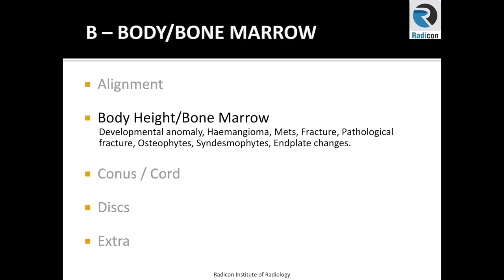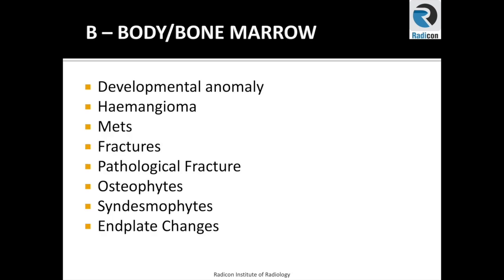Next is body height. In B for body height, we will have a quick look at developmental anomalies, hemangiomas, mets, fractures, pathological fractures, osteophytes, syndesmophytes, and end plate changes.